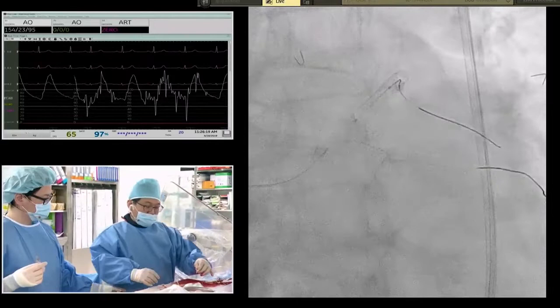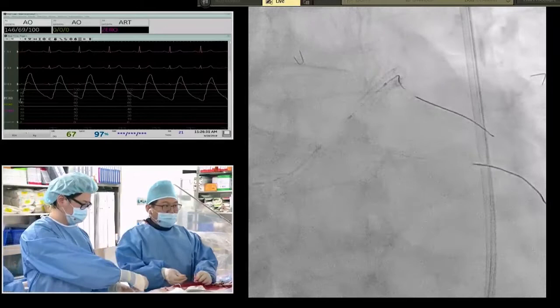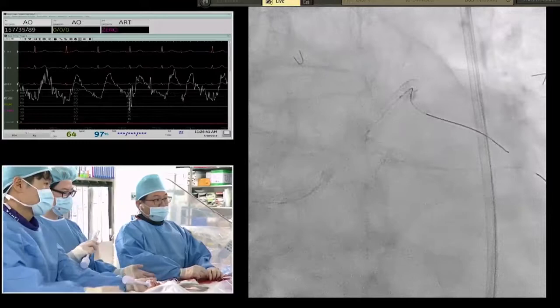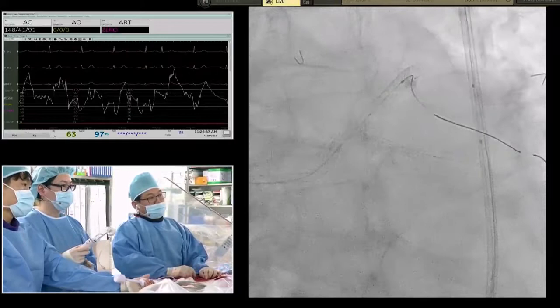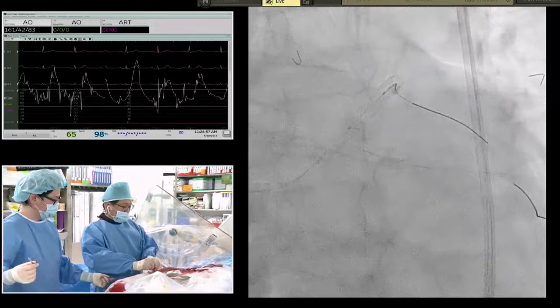Pre-lesion modification is very important, particularly for treating the heavily calcified lesion. Once you implant the stent, further dilatation is almost impossible without an aggressive debulking device. So talking about the lesion preparation for the circumflex ostium, is a cutting balloon or scoring balloon better than just ballooning? Some of the European studies show that cutting or scoring balloon plus stenting is better than just regular balloon. But the issue is the crossability of that cutting balloon and scoring balloon for this very tight, highly angulated lesion.